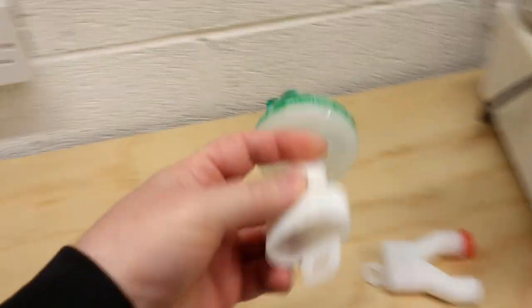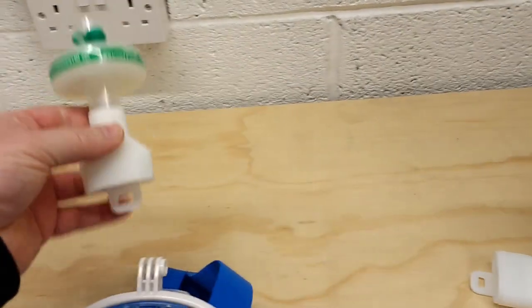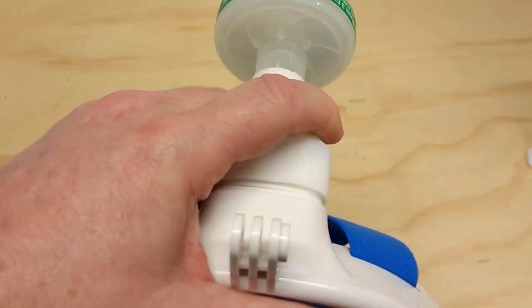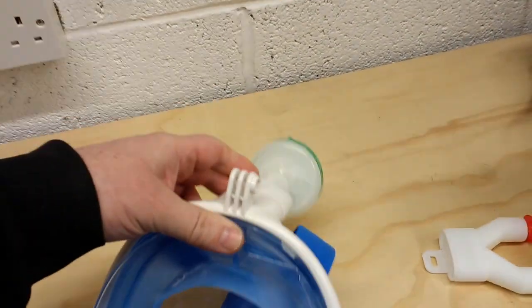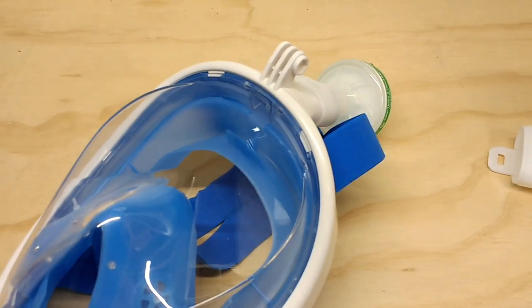For our first test we're going to use the adapter which blocks off the lateral ports, with a single filter. It fits pretty well, locks into place, and we'll breathe on this for about 10 minutes and see what my end-tidal CO2 stabilizes at.